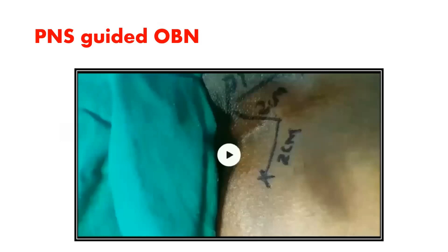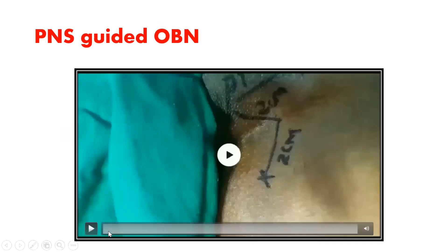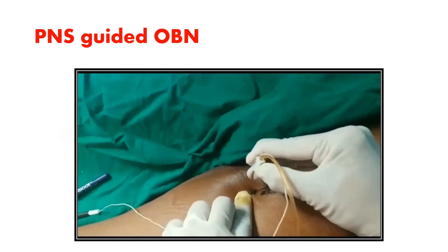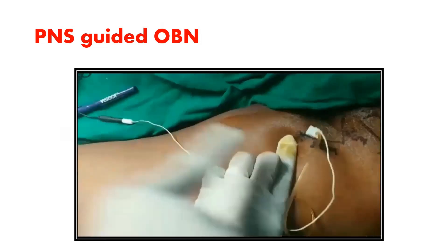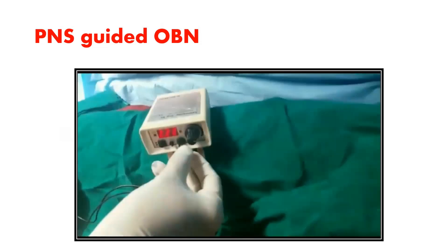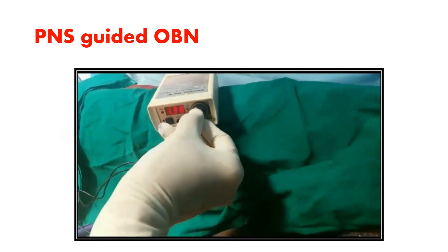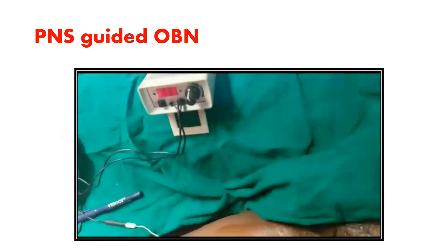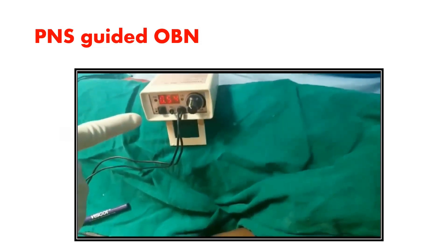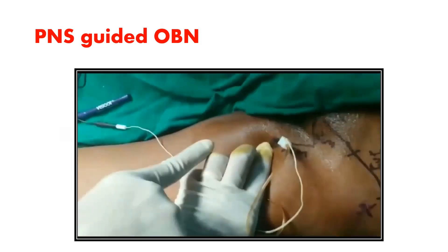For the PNS-guided obturator nerve block, the evoked motor response is contraction of the thigh adductor muscles. The point of needle entry remains the same — 2 cm lateral and caudal to the pubic tubercle. Go in perpendicularly and you get adductor muscle contractions. Slowly reduce the current; at around 0.5 mA, you still get adductor muscle contractions.